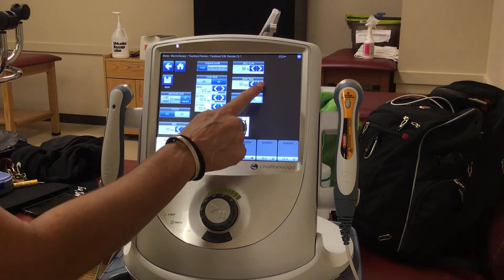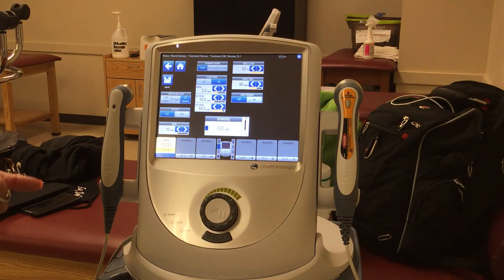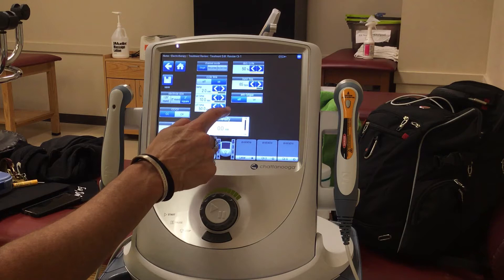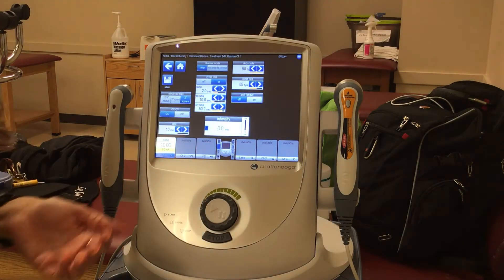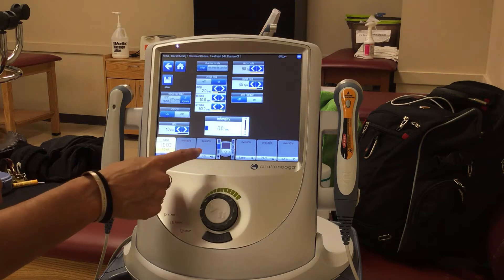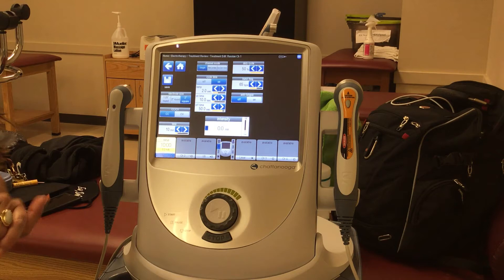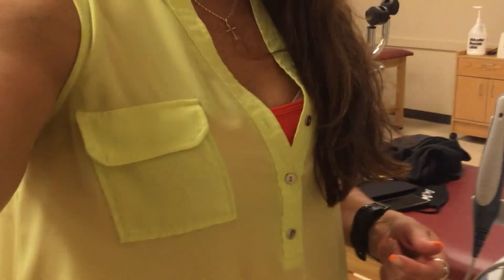Duty cycle we don't change. For burst frequency, we can change that — it goes anywhere between 50 and 70 pulses per second. We'll leave it around 65, but we can change it to 70; it depends upon your patient and their comfort. We're going to leave the anti-fatigue off, and then we start turning up the intensity. What you should tell your patient is that it should be uncomfortable — it's not just a tingling. It's actually going to result in a real contraction.